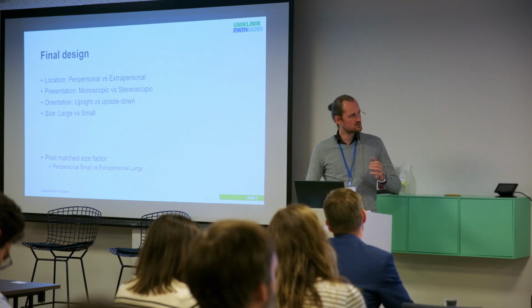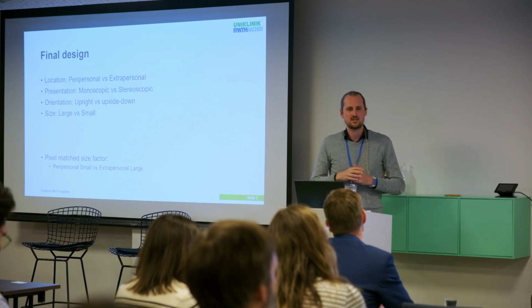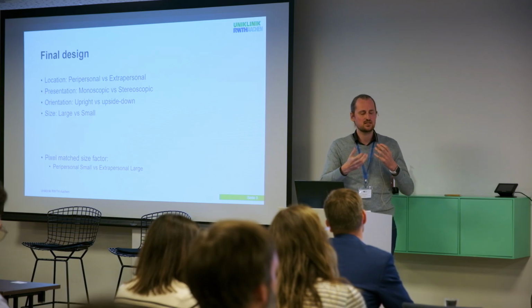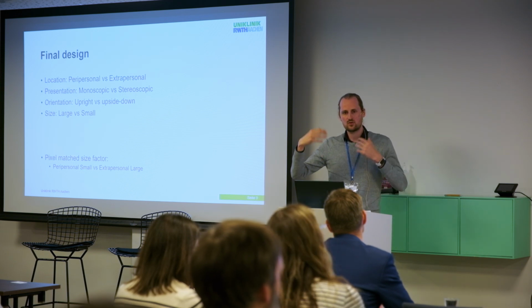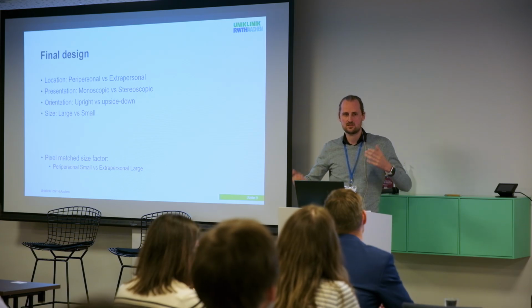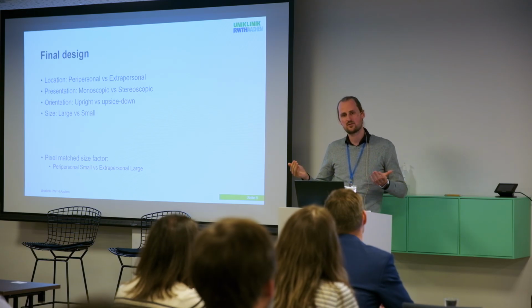Specifically, this size control is quite interesting. So we noticed in a previous behavioral study that we did not control for size. We simply generated this three-dimensional cup. I noticed the problem: if you have something close by, obviously it is a larger stimulus than far away. Even though cognitively we process them as being the same size because of this 3D effect, visually, pixel-wise, it had a different size, so we were worried whether this would actually influence our data.